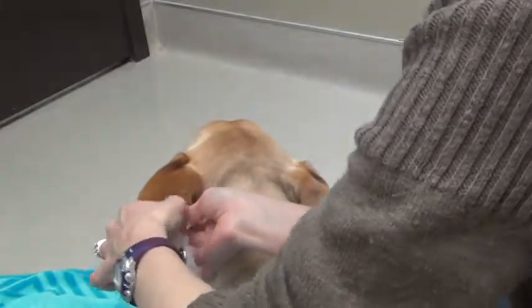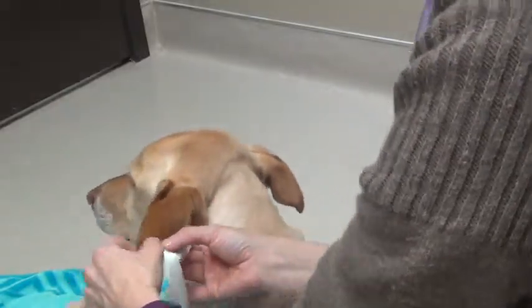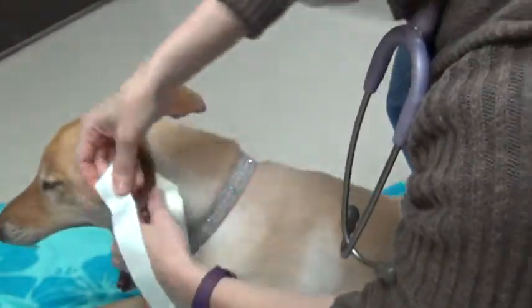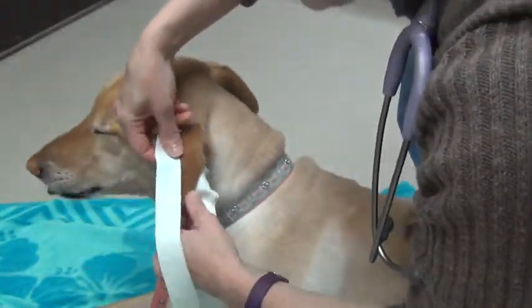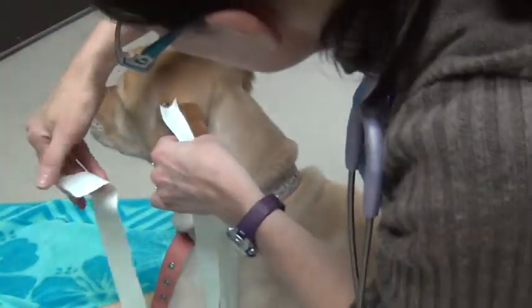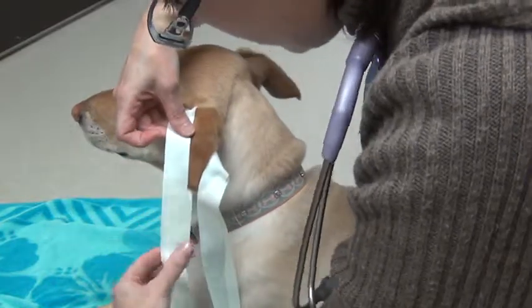So we're going to use another piece on there. We're making our stirrups, covering just the outer tips of the ears. She's being a good girl. That's a good girl. Very good girl. Alright, so we've got our stirrups ready.